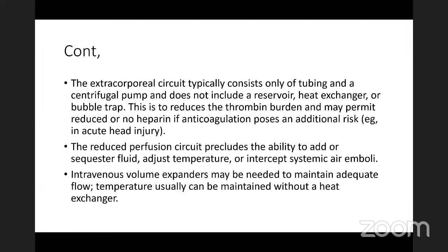So, as an extracorporeal circuit of bypass, it typically consists of only tubing and a centrifugal pump. It does not include a reservoir or heat exchanger or bubble trap like the full cardiopulmonary bypass. This is to reduce the thrombin burden, which may permit a lower heparin anticoagulation.